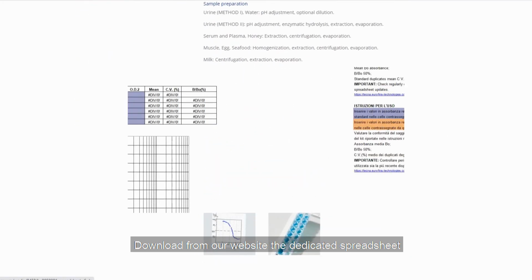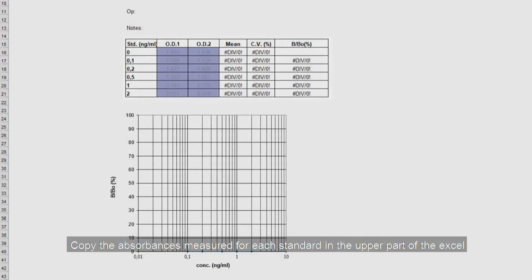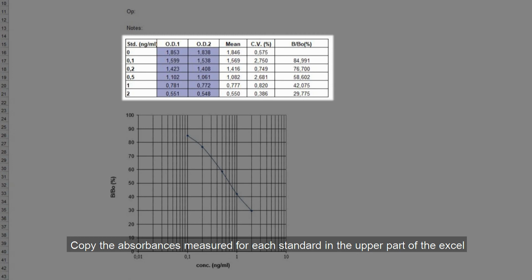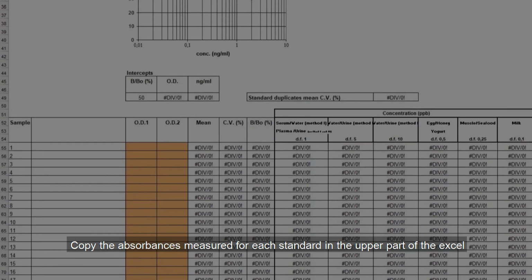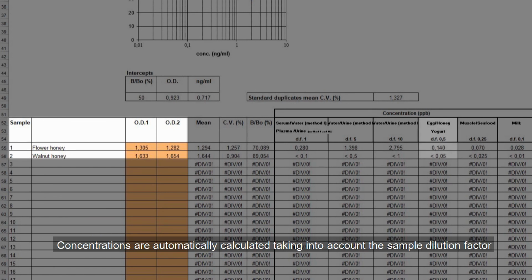Download from our website the dedicated spreadsheet. Copy the absorbances measured for each standard in the upper part of the Excel, and those of the samples in the dedicated table. Concentrations are automatically calculated taking into account the sample dilution factor.